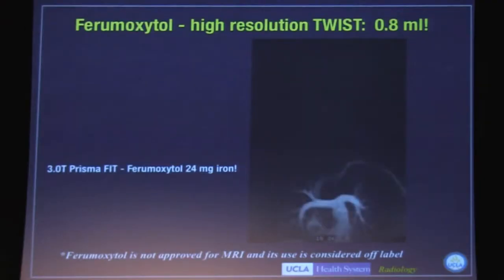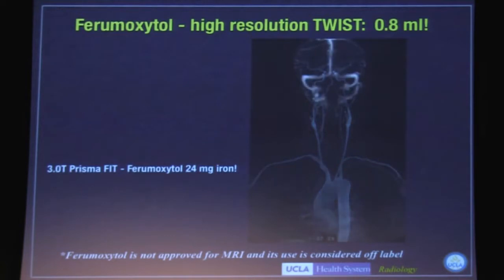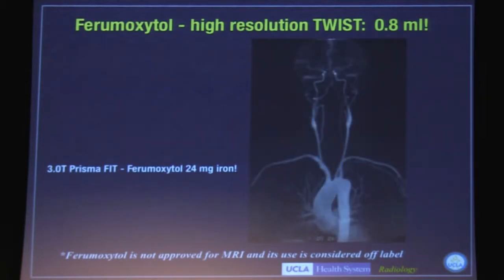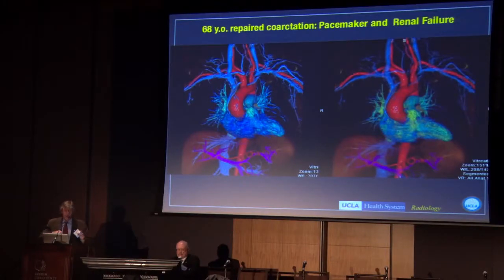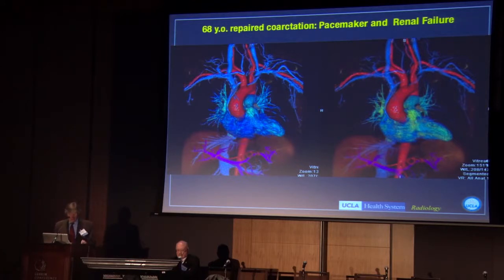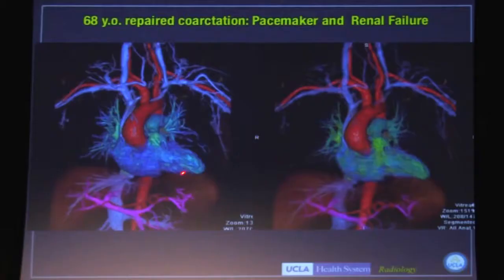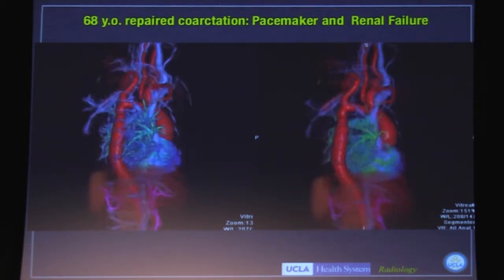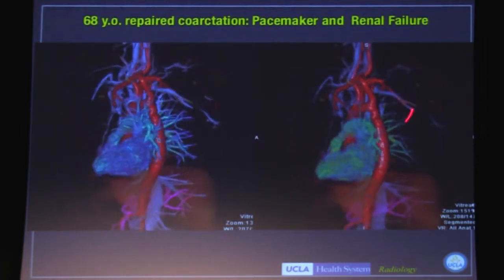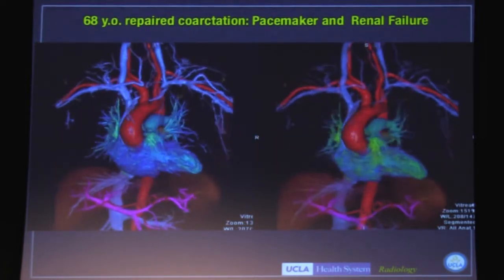Here we see dynamic first-pass imaging of normal thoracic and carotid arteries using basically 0.8 mLs of this agent — just 24 milligrams of iron, almost nothing. Here's a patient with a repaired coarctation who also had a pacemaker and renal failure. This agent enhances the entire blood pool, so as you can see on the left, you can see pretty much everything equally bright — systemic veins, systemic arteries, pulmonary arteries, pulmonary veins, portal vein. And with software, we can damp down some structures to highlight others.